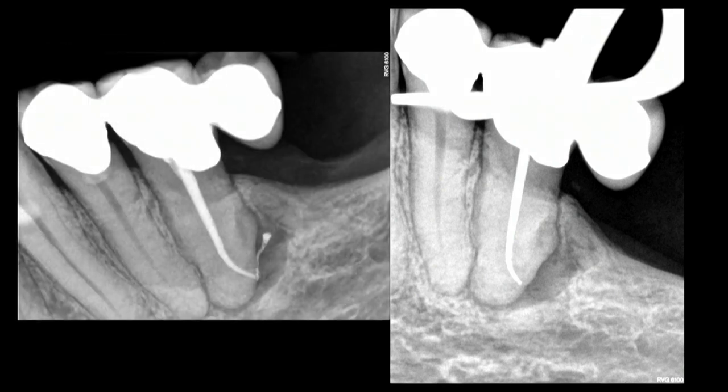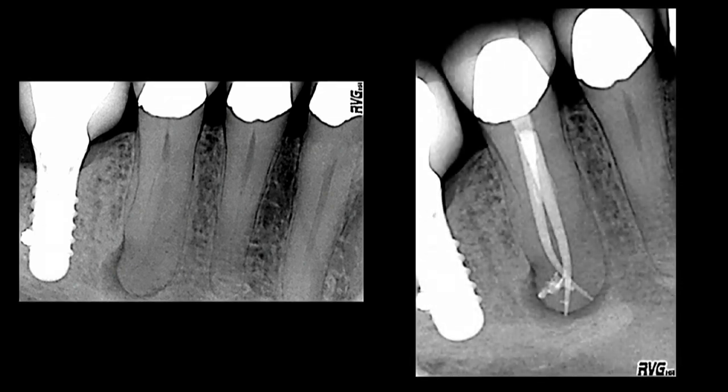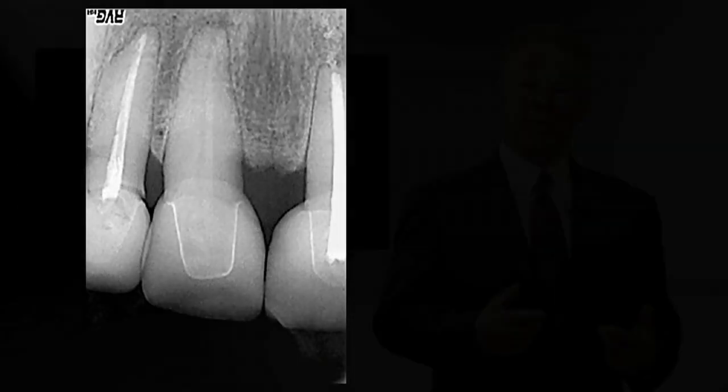Slender shape for slender roots, not too big, not too small. Smooth walls, enabling anatomy to be filled along the way. The treatment tooth is right in front of the implant. And when we see, of course, a canal that disappears up high there, we know it's going to branch, as it did in this instance. And this happened to be finished with the X2 and the X3 more in the body. But you can see the canals were beautifully followed, and the results probably two-dimensionally exactly what we want.